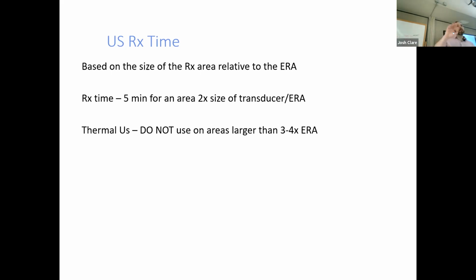Now, one thing I want to say about all the machines. For your skill comps practicals, use a machine you're comfortable with. If you like this one over that one, I think for diathermy, those ones were a little bit easier to operate than the Chattanooga ones in general, right? So grab the machine you're comfortable with, but play with all of the different kinds, because sometimes if those machines need to be repaired, the vendor will drop off their loaner ultrasound machine, and it's going to be a lot different than what you've got.